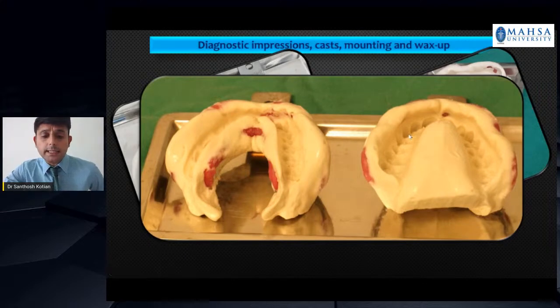Another advantage here is, even if you might question that the wax is exposed inside over here, it's still okay, because wax is also an impression material, and because of the oral temperature, the wax gets molded over there, and you still get a proper recording of the tissues. It's always better than the tray being exposed.